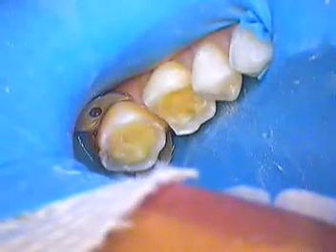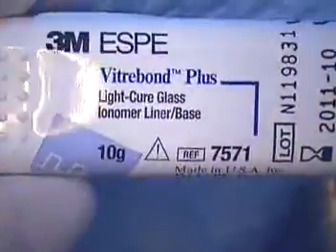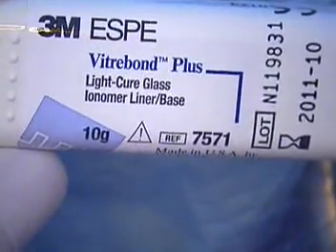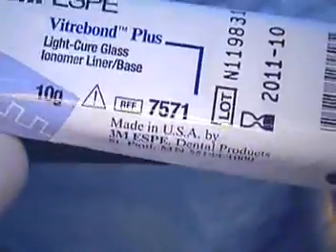We just mixed it on a pad. It's Vitro Bond, and they do come in a dispenser now. I wanted to make sure you saw that we were putting that liner in. It is light curable, so we're going to do that next. This is what it looks like — 3M is the company, Vitro Bond Plus, and it's a light cure glass ionomer liner base.